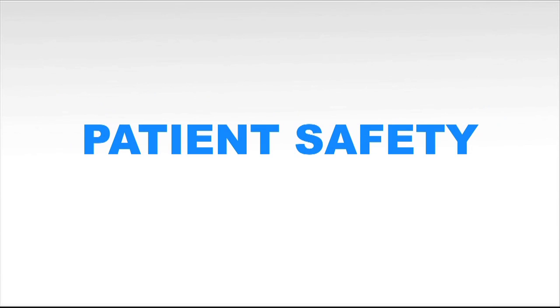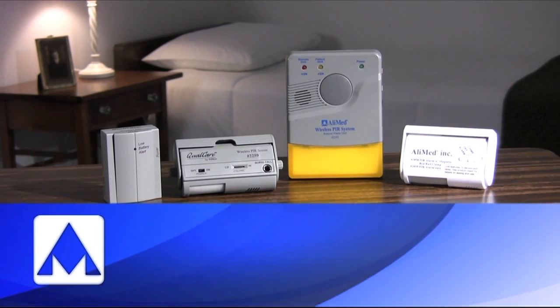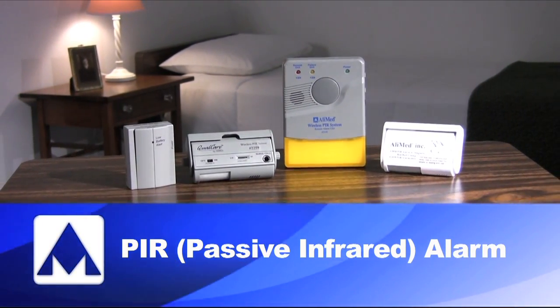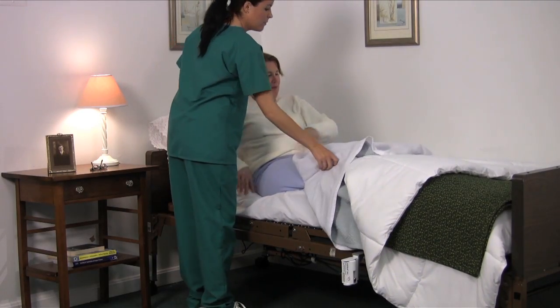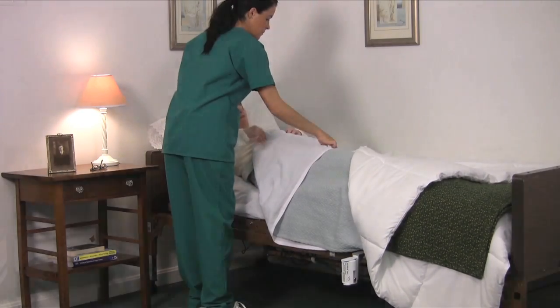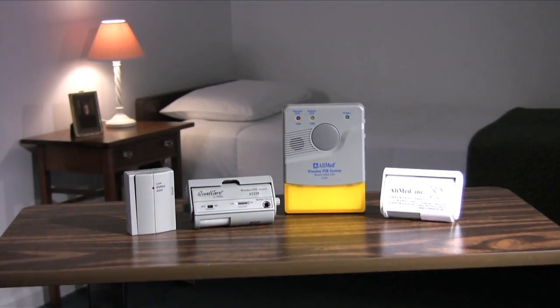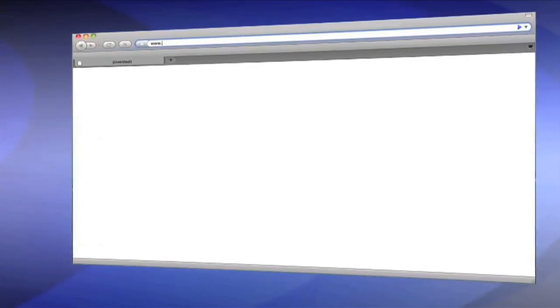Welcome and thank you for choosing Alimed as your partner in patient safety. This demonstration features our easy-to-use PIR passive infrared alarm. We'll explain how this high-tech motion sensor alarm is an exceptional way to offer the best inpatient care, and it's just one of the many high-quality patient fall alarms offered by Alimed. For additional information on products, please go to Alimed.com.